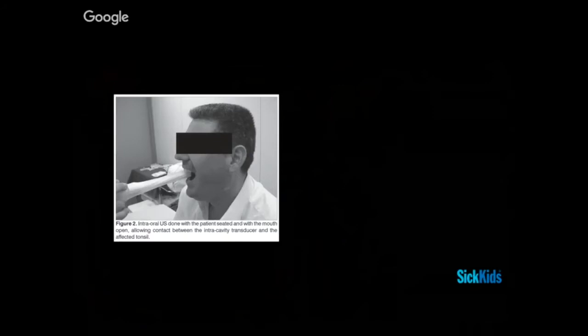It's important if you're undergoing this type of ultrasound that you have proper infection control in your site. Often these probes have to be cleaned specifically by the hospital and cannot merely be wiped down. They also require a sterile casing.